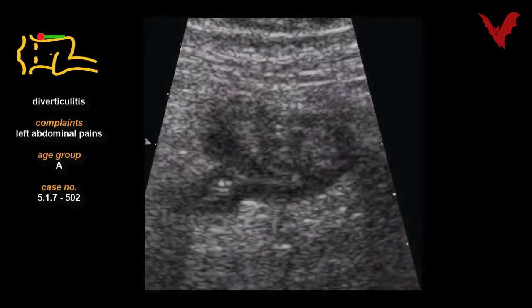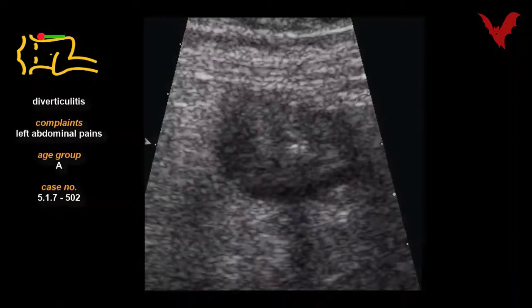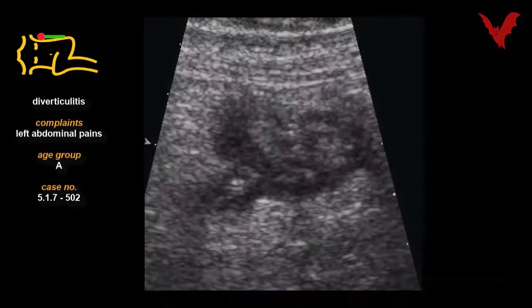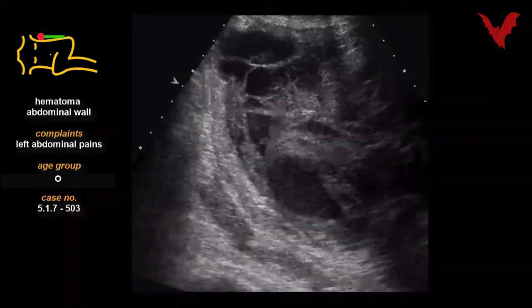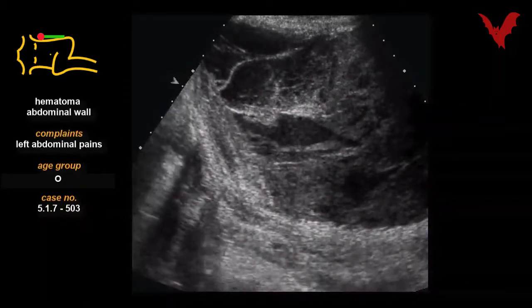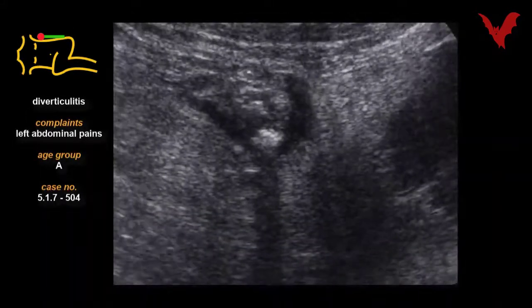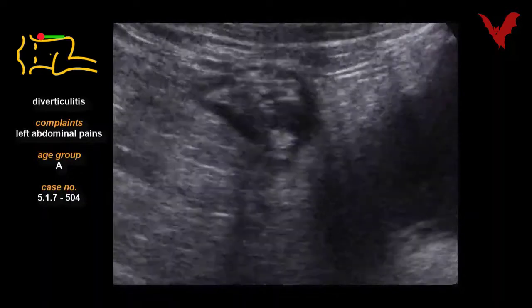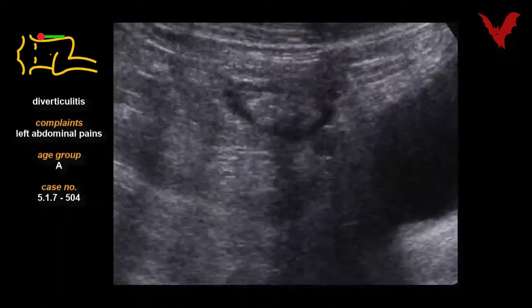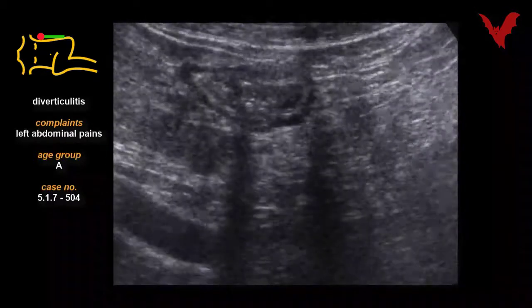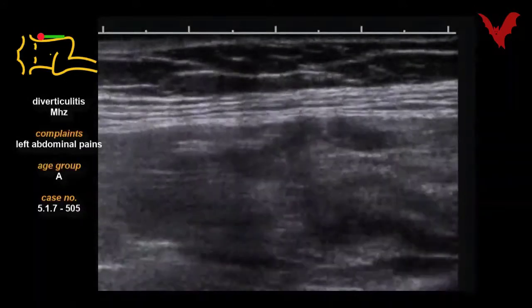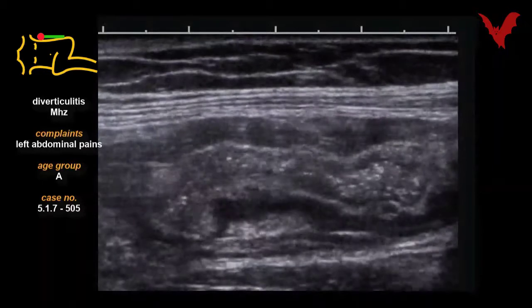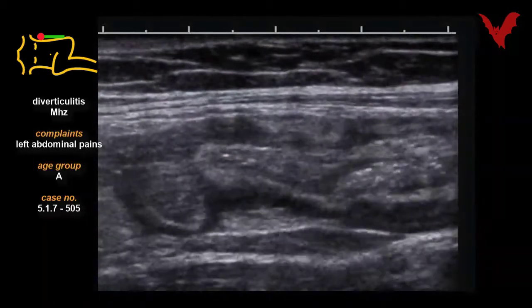In case 503, a complication after fine needle puncture and hematoma of the abdominal wall is shown. Case 504 returns to the topic of wall thickening in diverticulitis. Case 505 shows marked signs of inflammation.